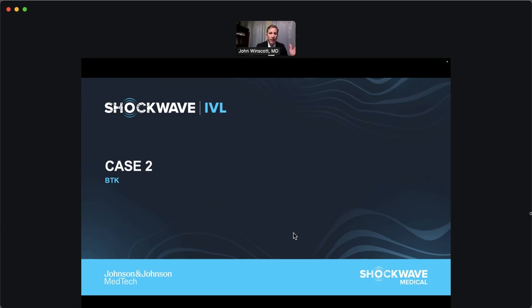That's a great point that we really hadn't made up to now. If you cross with your wire and then lead with Javelin, then you can IVUS behind that on these difficult to cross lesions and then choose your appropriate size balloon. Whereas if you were going to go in with E8, you really need to choose E8 sizing appropriately from the get-go. And if you don't have an idea of how large that vessel is, you could choose inappropriately. And we all know how important sizing is with tibial vessels.